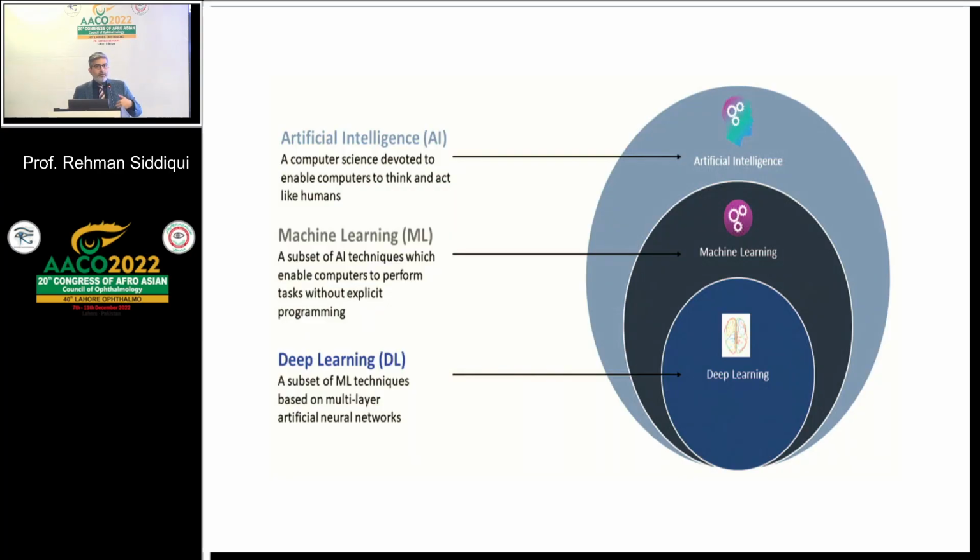But the reason artificial intelligence has taken off recently is deep learning. With deep learning, you don't have to tell the machine where the microaneurysms are. Because if you do, and I have done that work, it's extremely laborious, time consuming and boring. But if you label the image, if you look at a retinal fundus image, they say this is diabetic retinopathy, this is not diabetic retinopathy, this is grade 1, grade 2, as Dr. Jasek has pointed out, we use ICDR classification.